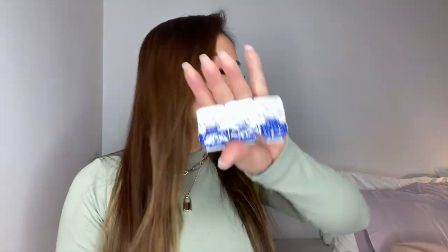And also, if you're using hydrogen peroxide at the end of the day, that will clean everything off the lens anyway, so it's going to be much easier for you. So these I really love. And then if we're talking about monthlies, all the monthlies I find are pretty easy to clean because the material is a bit thicker, since they're supposed to last you through one month, and they're really easy to slide off and clean.